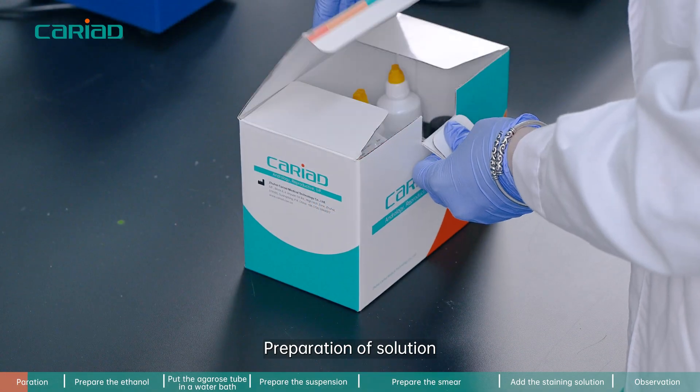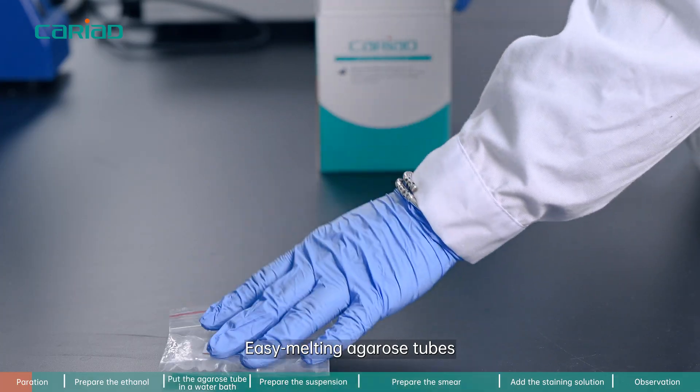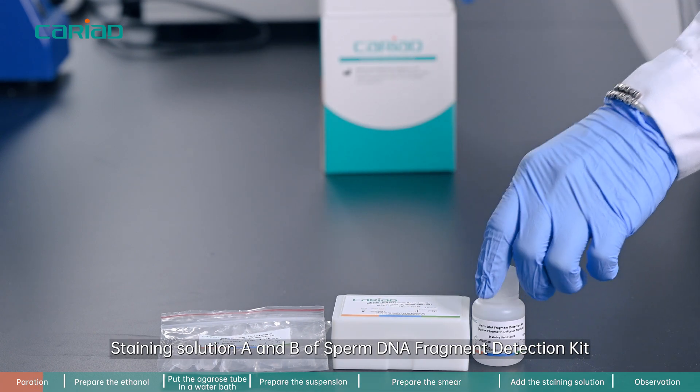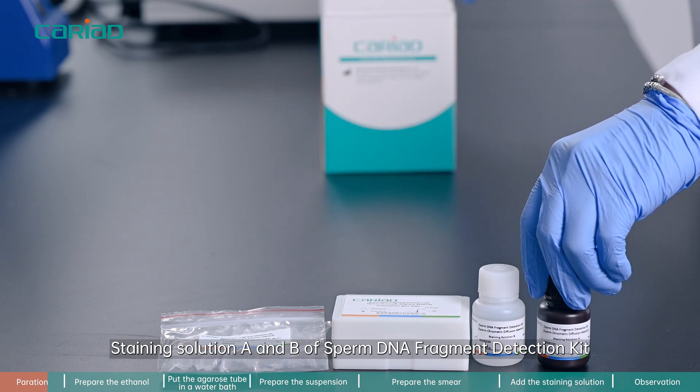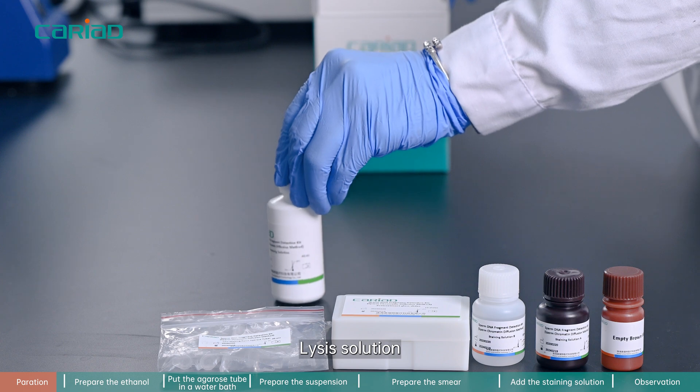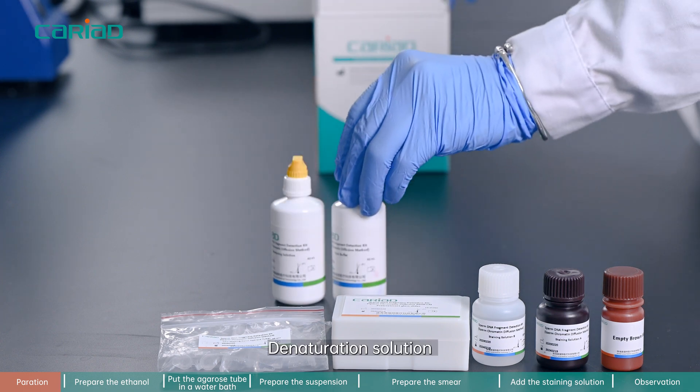Preparation of solution. Required kit components include: easy melting agarose tubes, slides, staining solution A and B of the sperm DNA fragment detection kit, an empty vial for solution preparation, lysis solution, and denaturation solution.